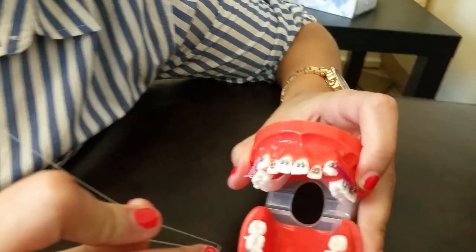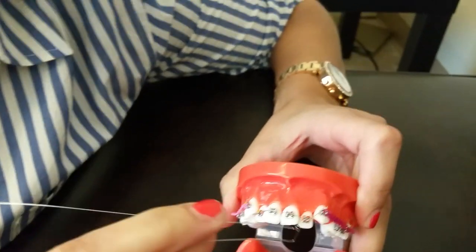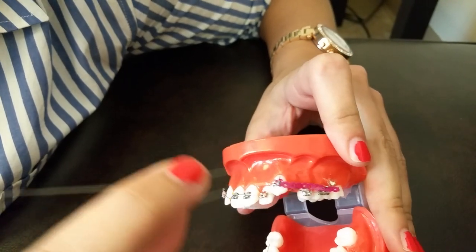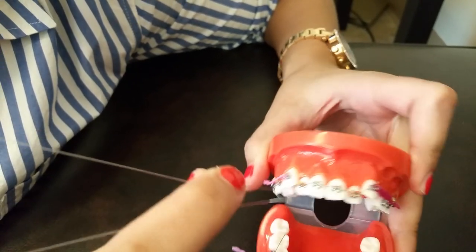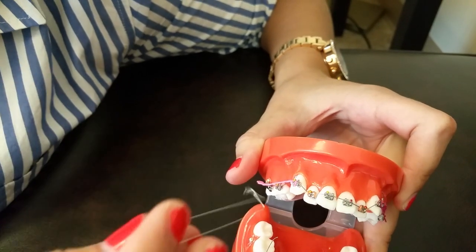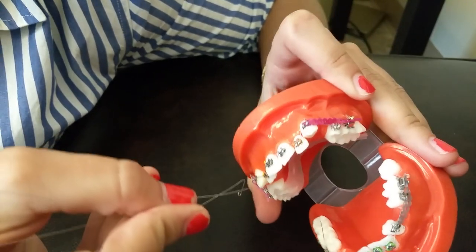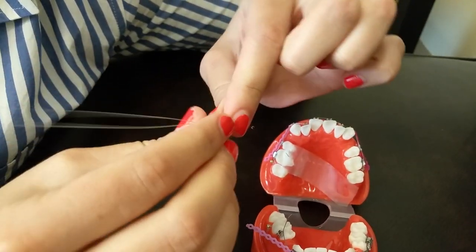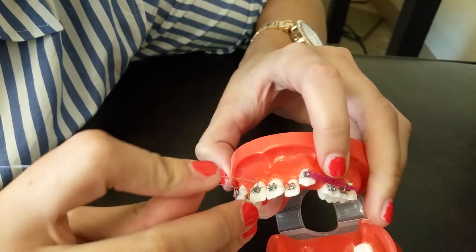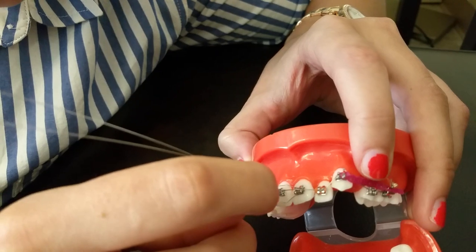When you're in the mouth, from the midline over on one side you always want to place the stainless steel wire this way, and if it's from the midline over to the other side you want to place it the opposite way. You want to pull it close to the bracket.